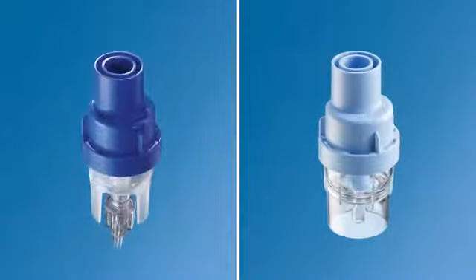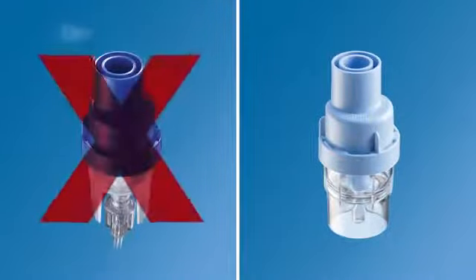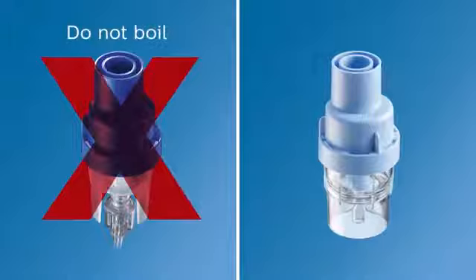The Philips Innospire Essence comes with a dark blue SideStream nebulizer. This means it is disposable and should not be boiled. It's recommended that you replace your SideStream according to your instructions for use.